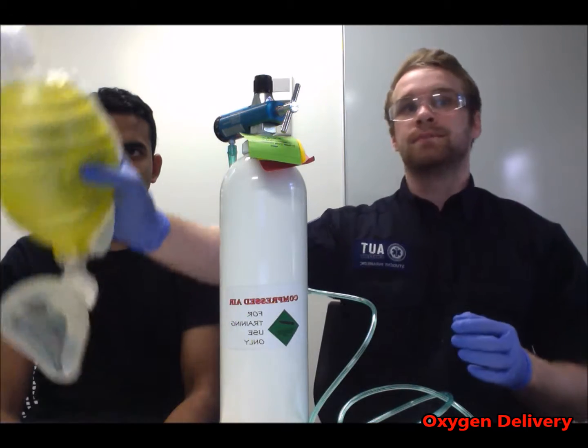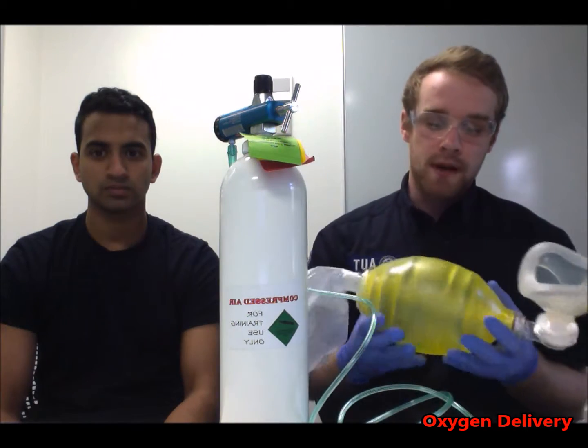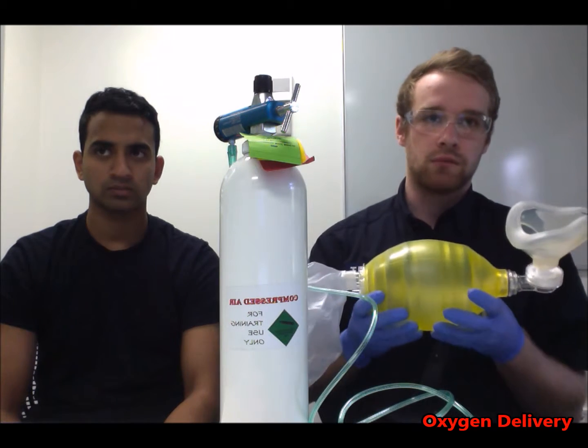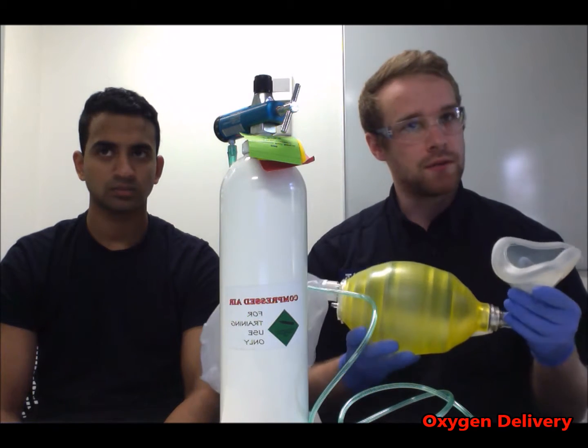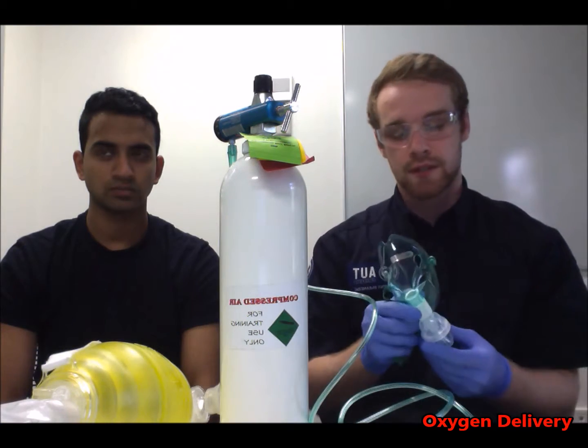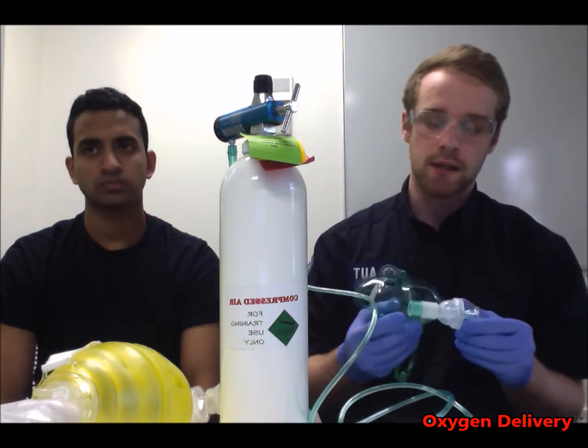And then you have your bag valve mask and reservoir, which delivers 98% of oxygen when the tank is turned on to 10 to 15 litres per minute. And lastly, you also have your nebulizer, which delivers 60% of oxygen at 6 to 8 litres per minute.